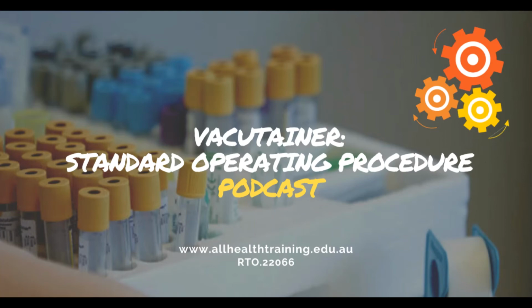Every tube has a vacuum in them. They have just the right amount to fill the tube with blood, so they will never overflow. If you are unsure if the tube is filled, simply remove the tube and hold it up to the light and check. But it's usually when the blood stops moving in the tube that it is full.